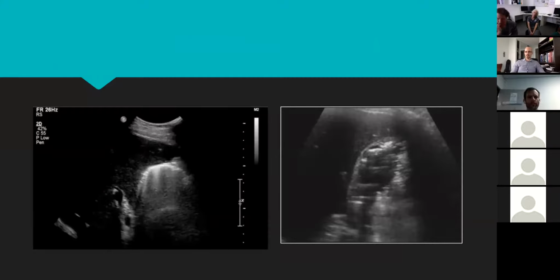You can see the gallbladder there with an echogenic area, but that echogenic area interestingly casts a dirty shadow. It's definitely in the gallbladder, but it's casting dirty shadow. Same as here, you can see an echogenic area coming in a horizontal, level-like pattern with dirty shadow.